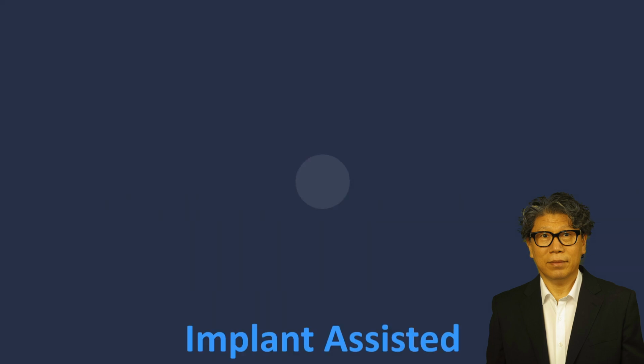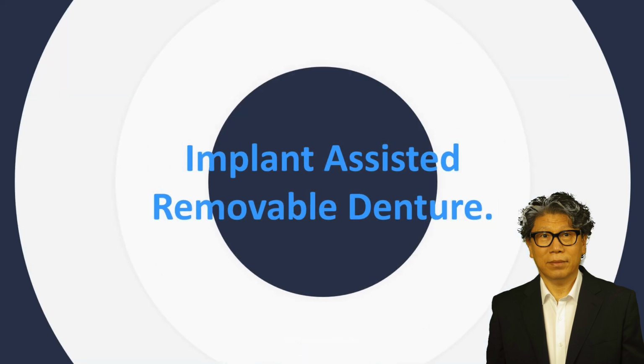I will talk about AllonX later. For now, I think it would be more appropriate to share a few more ideas and focus on implant-assisted partial dentures. Ultimately, in cases where there is severe bone resorption in the posterior mandible, implants can only be placed in the anterior region, making implant-assisted partial dentures unavoidable.